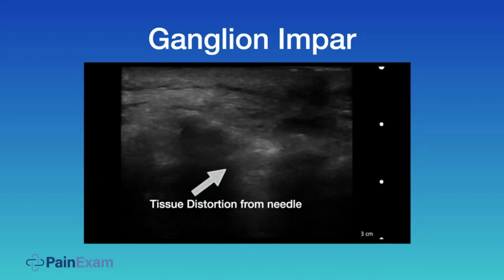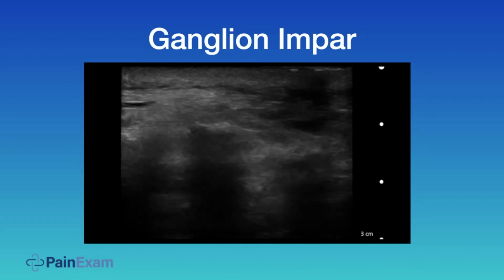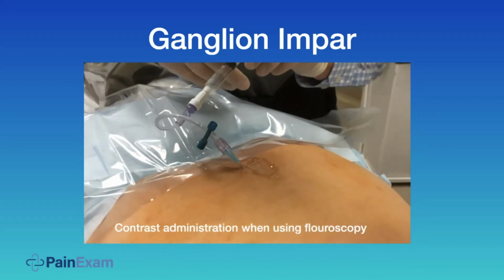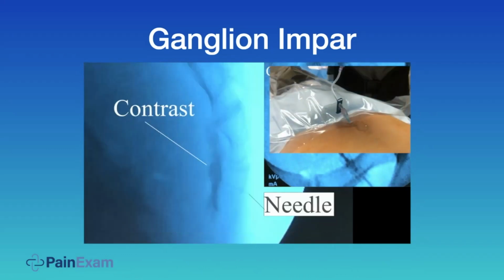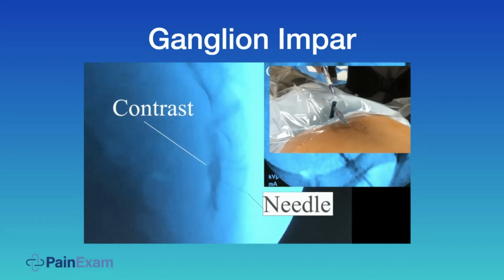Targeting. Here I'm using the X-ray as well. You see the spread is more back. There is a spread on the side.